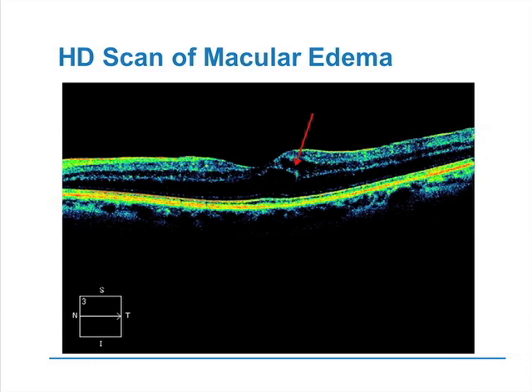You can see that the architecture of the macula is somewhat disturbed and looks almost bubbled up, and the red arrow on this slide points to cysts that are actually seen within the retina itself that cause that difference in architecture. Of note, macular edema is reversible after stopping fingolimod, and so you can actually follow the morphologic reversal of it using OCT. However, we're also using OCT to follow the axonal loss of MS over time.